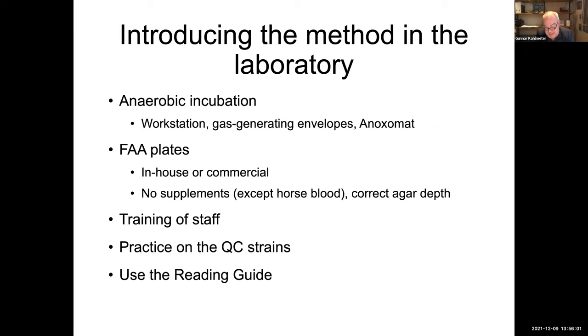So, questions about the testing process itself. I assume that the field laboratories that were doing the phase one and phase two, those labs who were reading these discs, were special sections of the labs. I'm assuming these are labs that are also reading aerobic discs as well. So they're kind of learning a new process, or were these done at special sections of each of the labs? I don't know if Jenny or Erica would like to answer that.